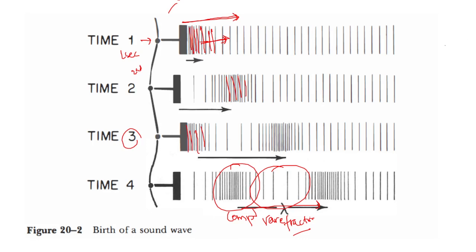So if you plot it on a sinusoidal curve, it will be something like this. There will be propagation of sound.